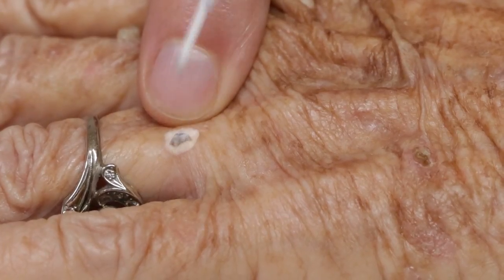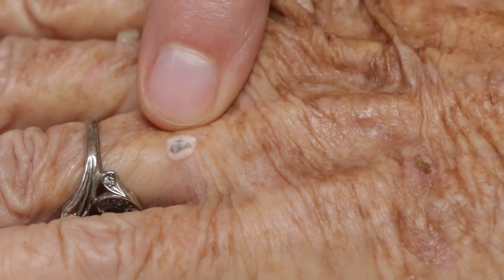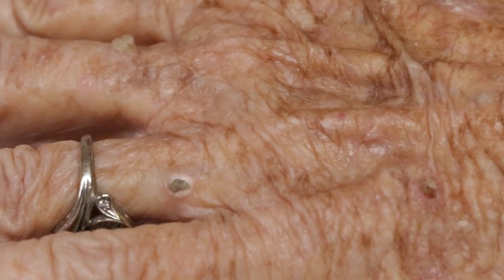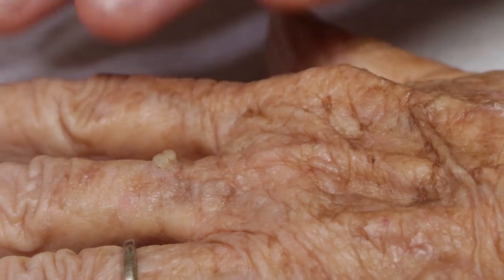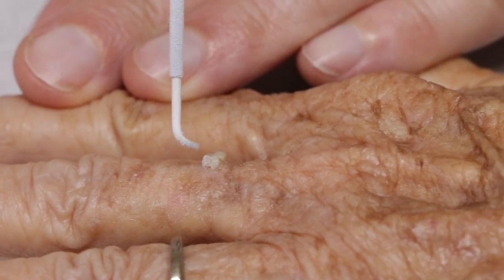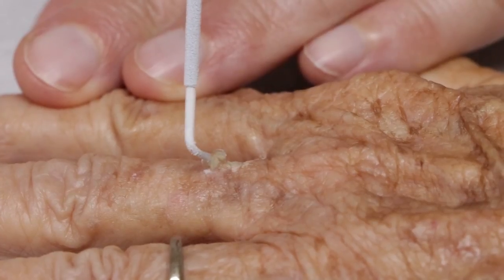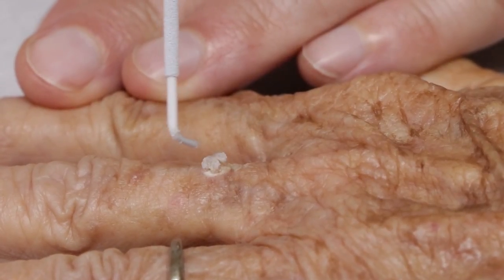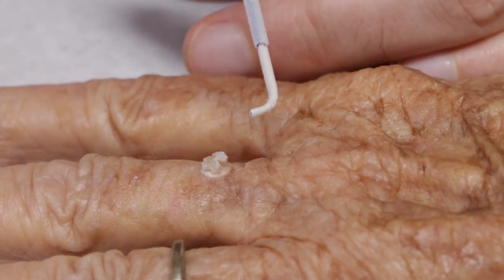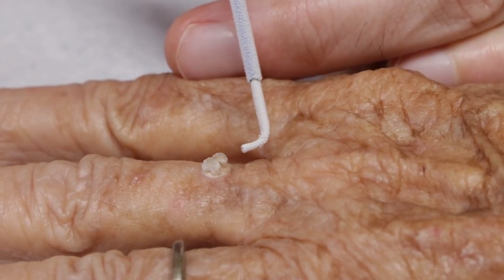I continue to get comments about how shaky my hands are. Do you think I have shaky hands? No. It's hard to get the keratin cold — it's an insulator rather than a conductor. So we get all around it.